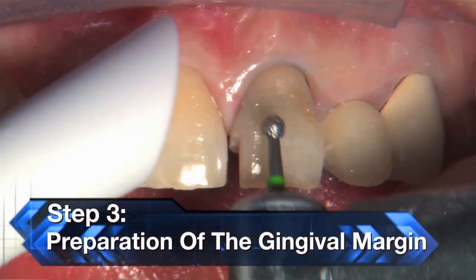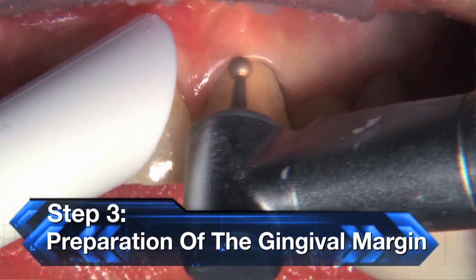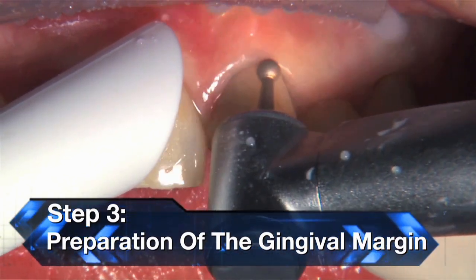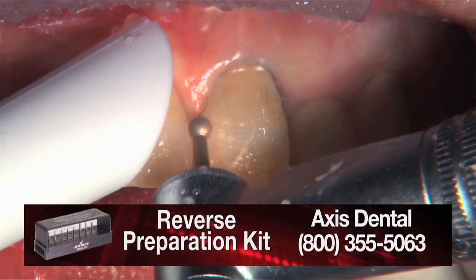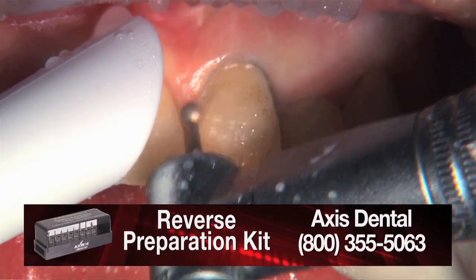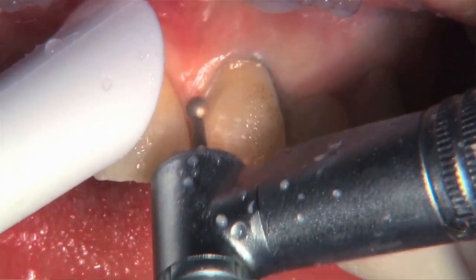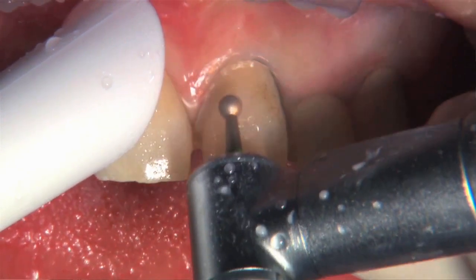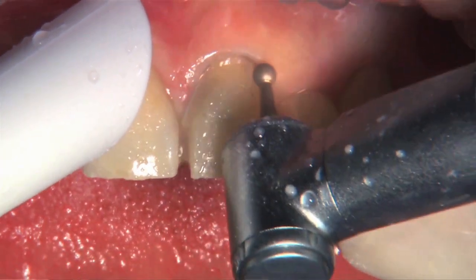So step 3 is going to be preparation of the gingival margin, and that's why this is called the reverse preparation technique, because in dental school I was taught to prep the gingival margin last, and here we're going to do it first. This is that 801-021 round diamond, and you can see that I'm using it trying to keep the shank parallel to the long axis of the tooth, and basically just prepping until half of that round diamond is into the tooth.